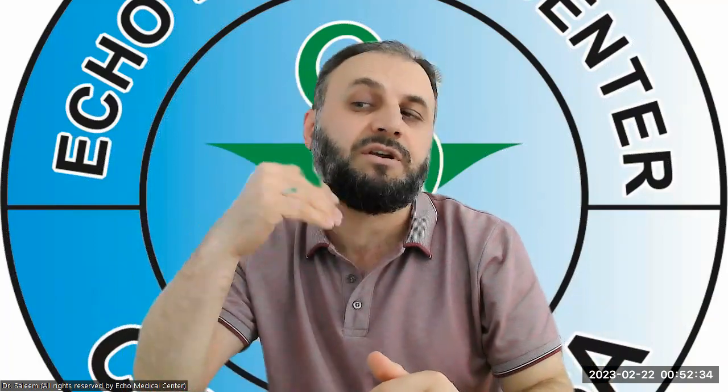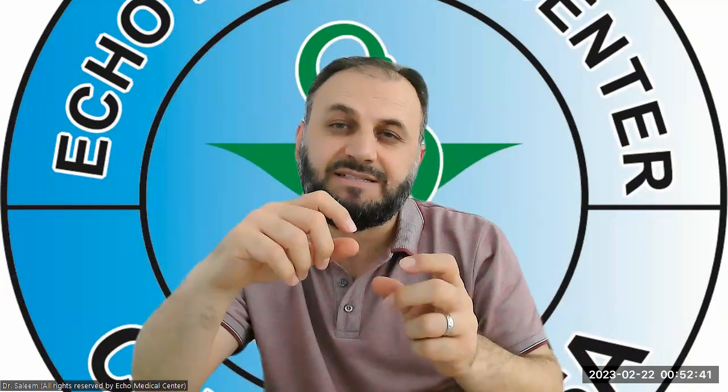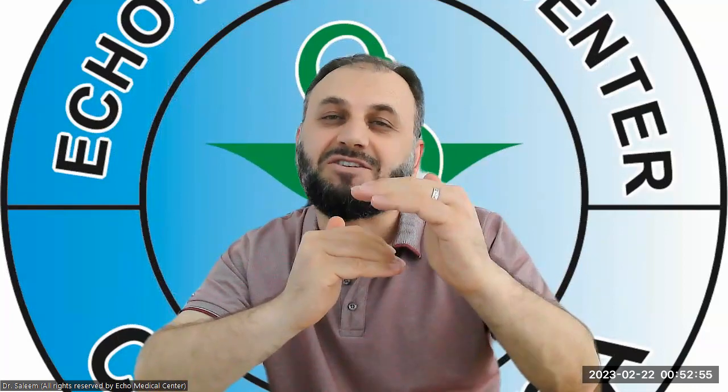And also the proximal and distal CCA, and then we go a little higher to the bulbous area, to the bifurcation. After the bulbous, we take the bifurcation to see the CCA separate into the ECA and ICA. These are all 2D images and color Doppler. Keep in mind that when you're taking the color Doppler images here, put your box in the center. No steer to the right and no steer to the left, because there we're looking to divide from 90 degrees. That's the only reason for that area.